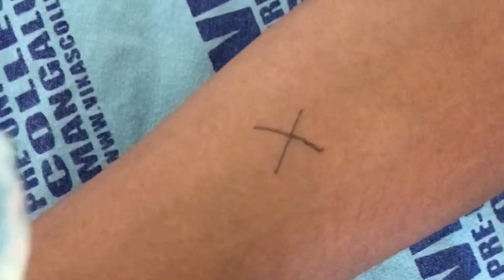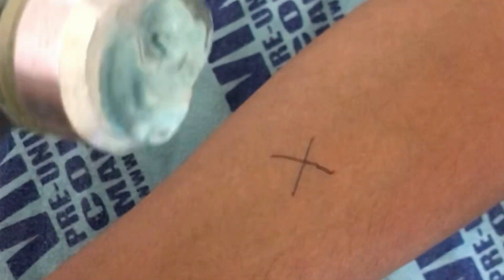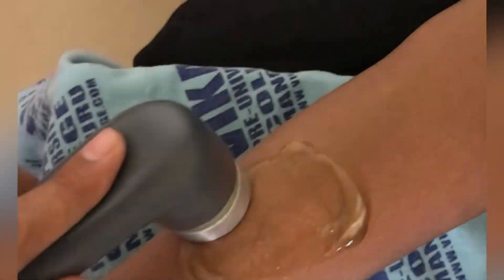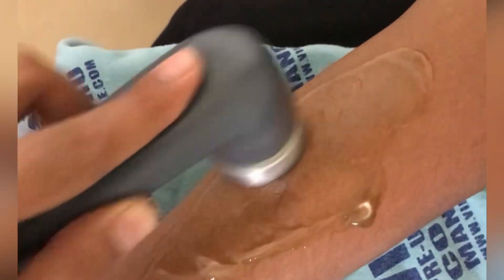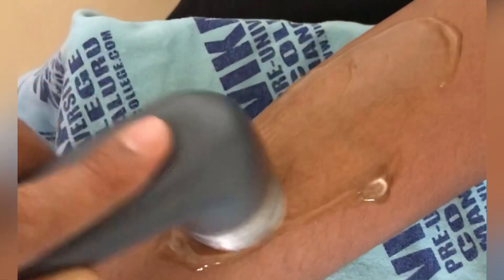Make sure that when you are using ultrasound, you are using it according to the head of the device and the treatment area. We should never treat beyond the appropriate area — we always have to consider the ultrasound head size relative to the treatment area.